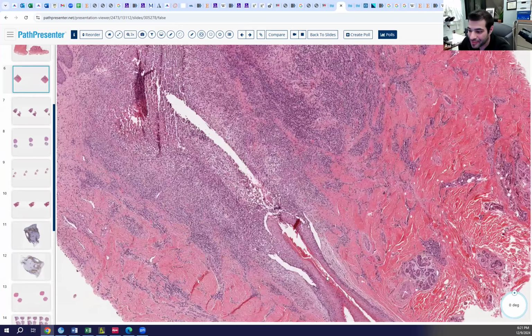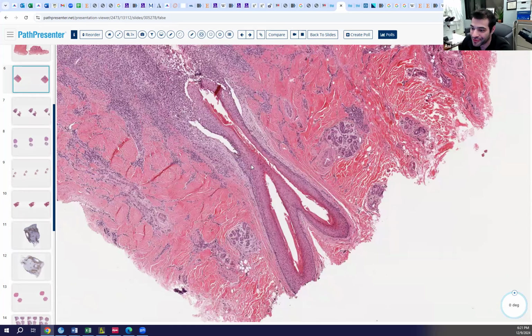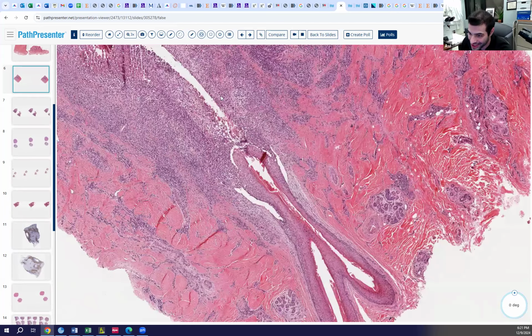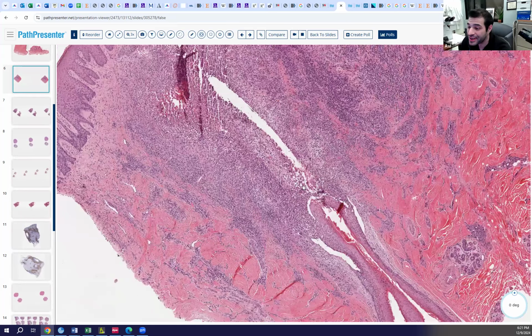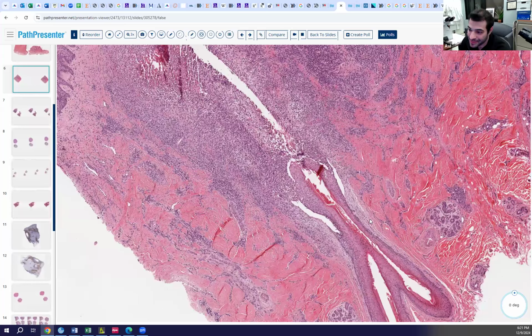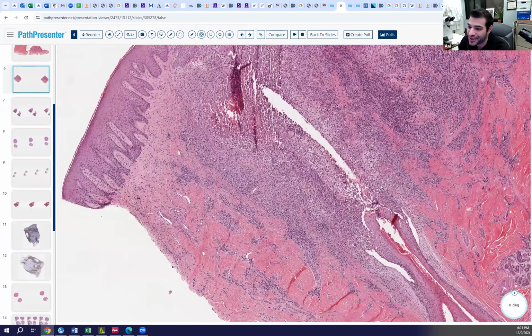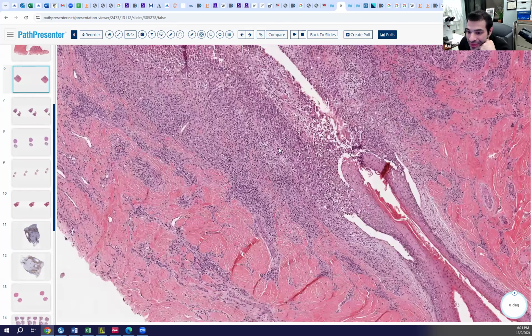Well, the point is there's going to be multiple hair shafts coming out of one follicle. You can see that if the hair shafts go back in here. Is it polytrichia? There is going to be polytrichia, but that's a finding, not the diagnosis in this case. It's not going to explain everything going on here. It's just a feature you see in this entity.